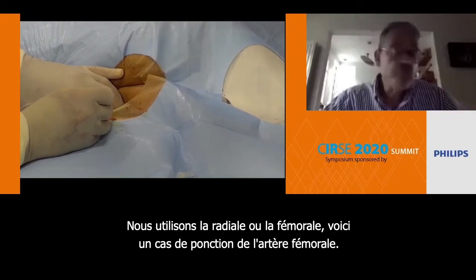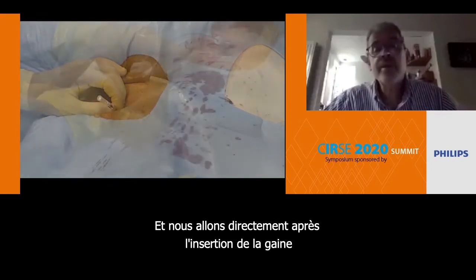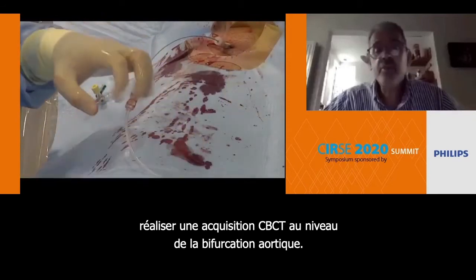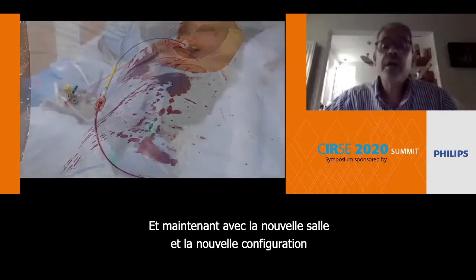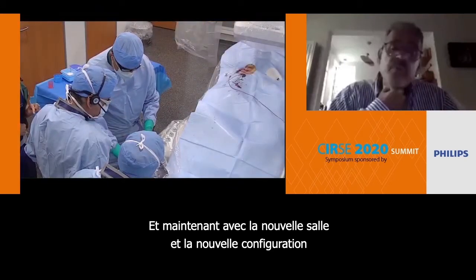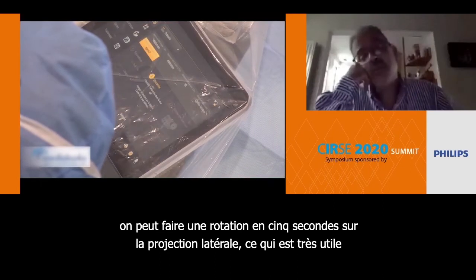So we go for femoral artery puncture. We use radial or femoral. Here is a case of femoral artery puncture. And directly after insertion of the sheath, we would directly go for global cone beam at the aortic bifurcation. And now with the new room and the new setup, we can do rotation in 5 seconds on the lateral projection, which is very useful.